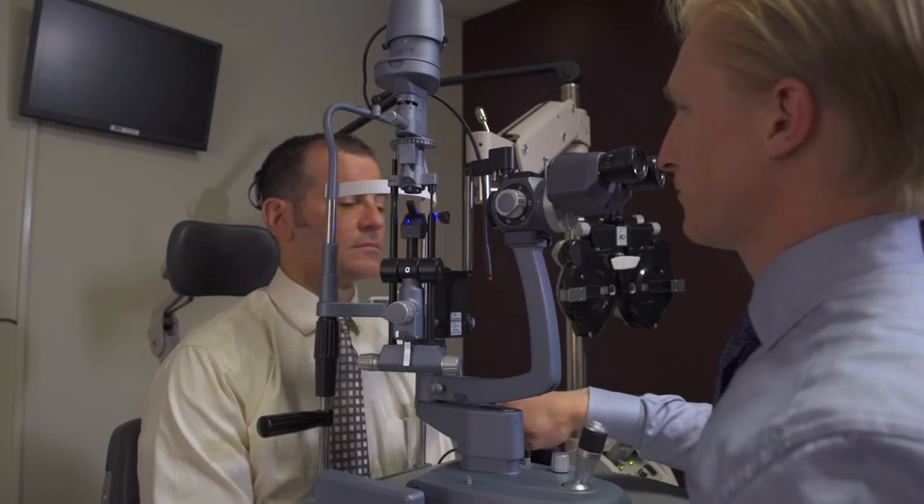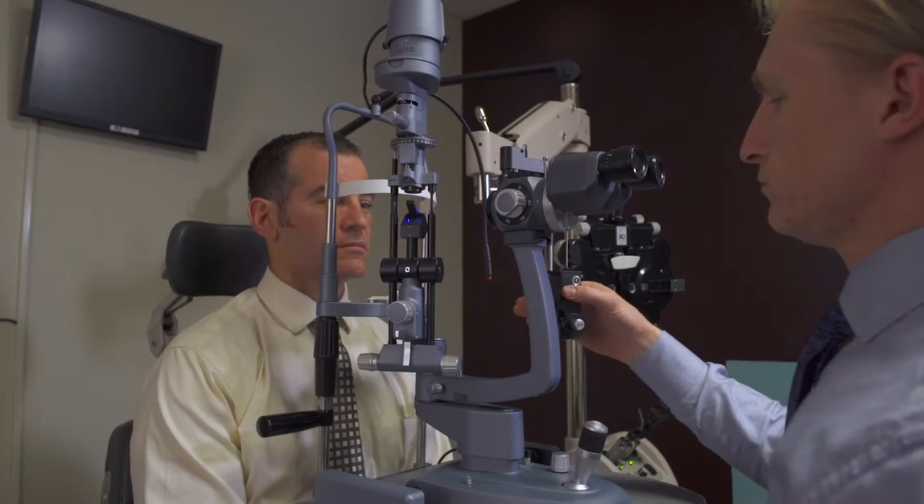Pressure is 14 today. Note that at the time of placement of fluorescein the eye was also numbed — otherwise the patient will feel the mires touch the front of the eye.